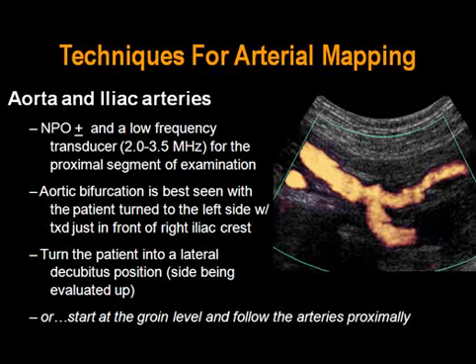NPO is a plus minus. We don't typically find that we need to have our patients be NPO. However, if that segment of the arterial system is gassed out, we will reschedule the patient after having the patient be NPO overnight. Typically, we use low-frequency transducers as these vessels tend to be deep for evaluating the proximal vessels. However, we find that this is not always necessary, and my recommendation would be to use the highest frequency transducer available that allows you to see all the vessels of interest.